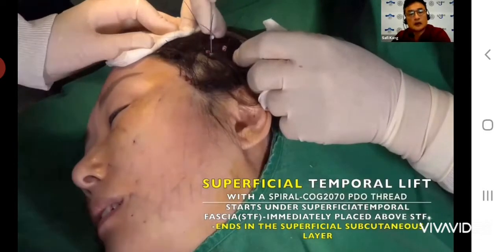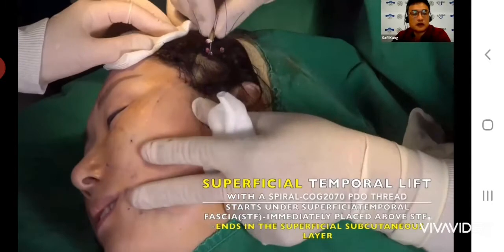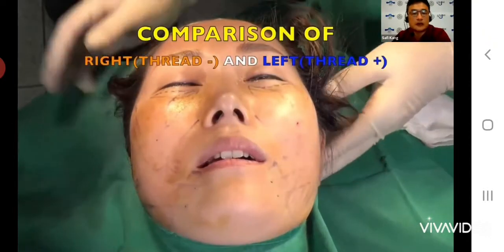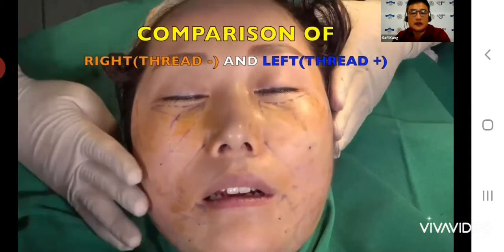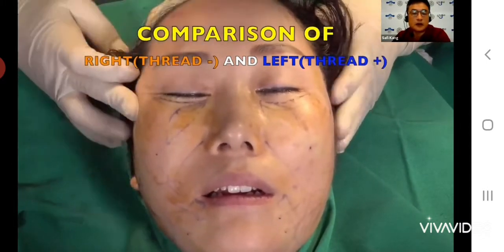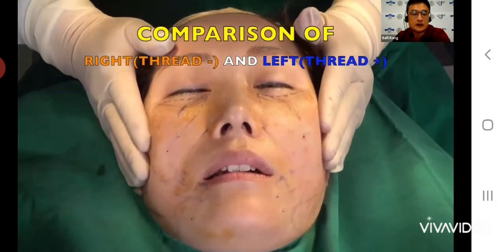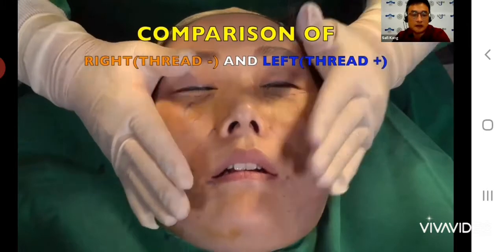Generally, when we just do the first step, the usual thread lifting, when we use the bi-directional cog thread, can you see here? Compare the right side thread lift with the left side. The mid-face contour, the width of the mid-face, is reduced here. The flattening, round, and this is the plating. So push down the soft tissue, you can see the different wrinkle texture.